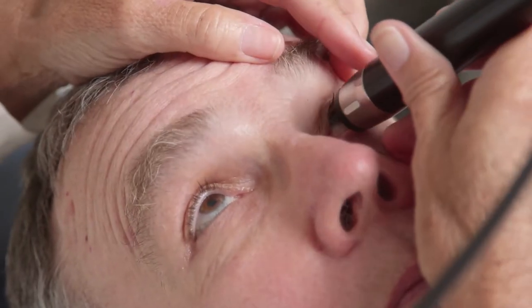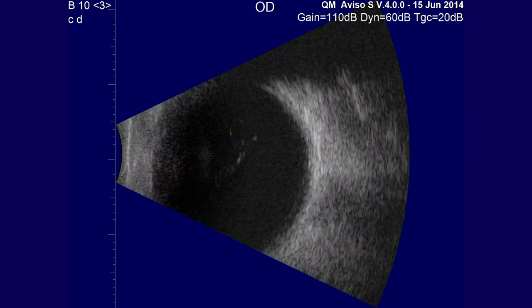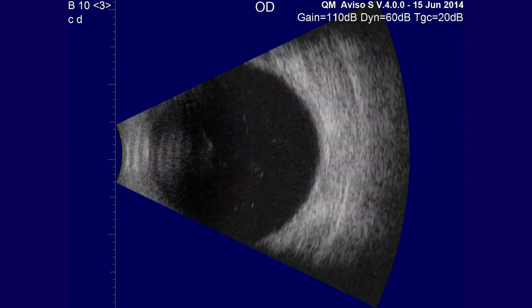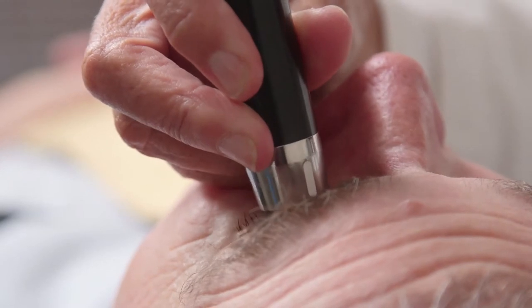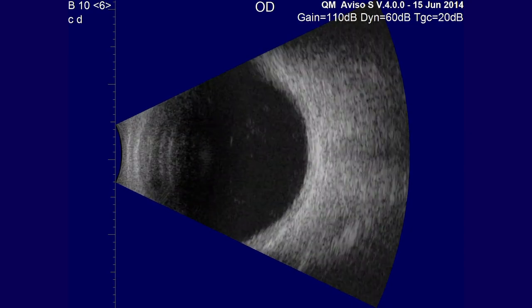When doing contact B-scans, the probe is always placed opposite the area to be examined, and the patient's fixation should be away from the probe. For transverse scans, the sound beam is aligned perpendicular to the fundus. The transducer housed within the probe moves back and forth toward the marker. The examiner should always localize the shadow of the optic nerve first, which indicates that the sound beam is aimed posteriorly. To evaluate the superior and inferior fundus, the marker is directed toward the nose — these are horizontal transverse or cross-sectional scans. To evaluate the nasal or temporal fundus, the marker is directed superiorly — these are vertical transverse scans because the sound is moving up and down.